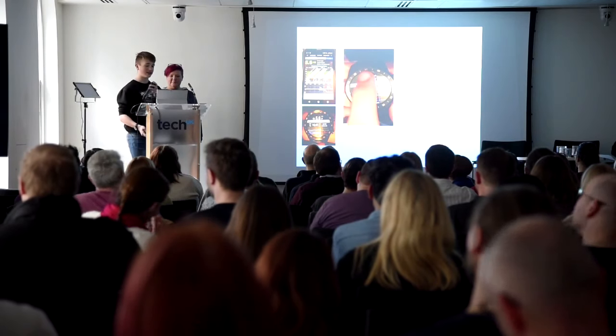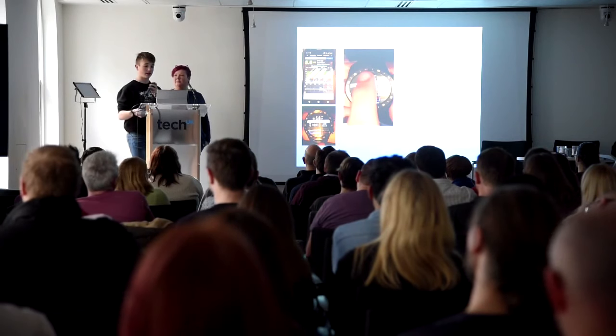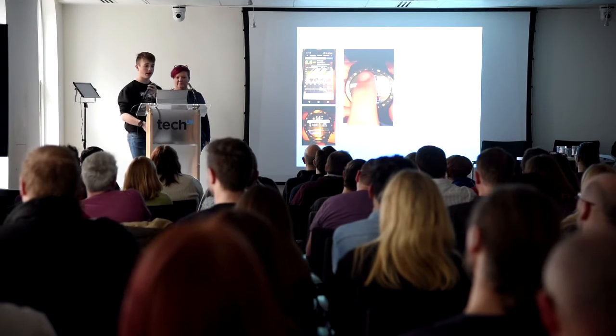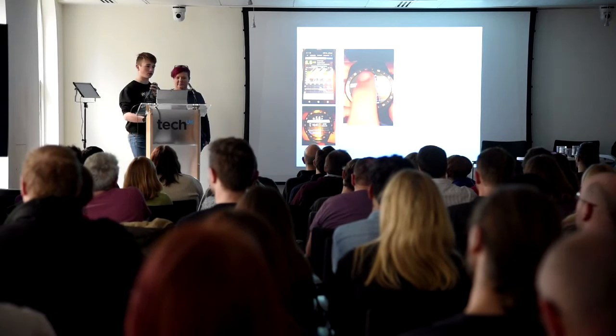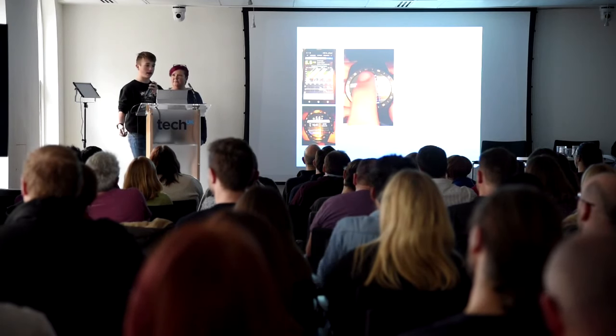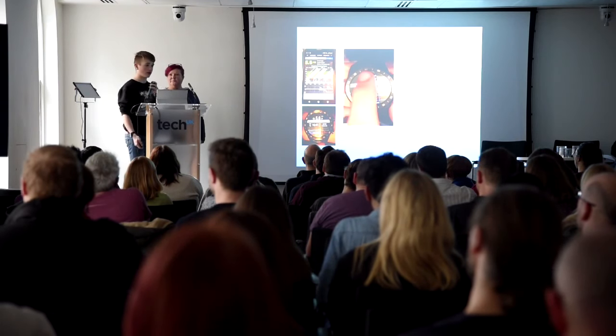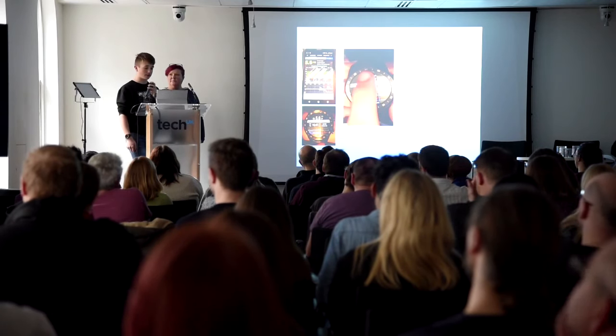Tim mentioned SMBs. They've been an absolute game changer, especially at the times on the side before. I'd be high, and they'd just be continuously giving, and they would give it at times that you wouldn't expect. Like I'd be at 5, and it would give me a little bolus of like 0.3, and you wouldn't normally expect to have a bolus for that.